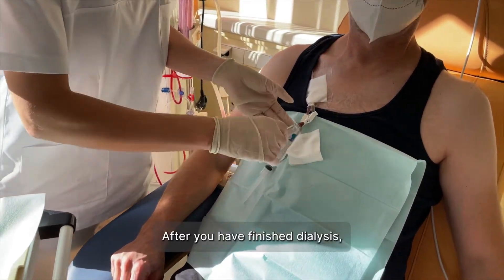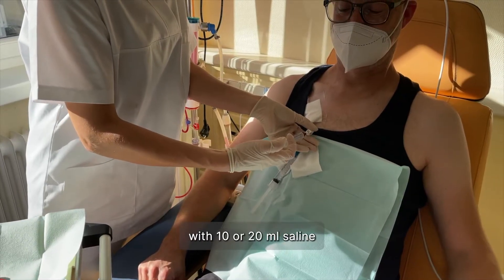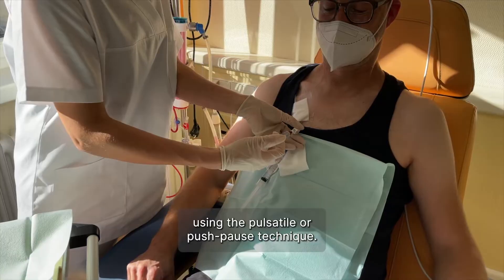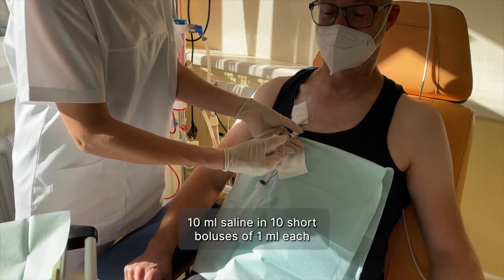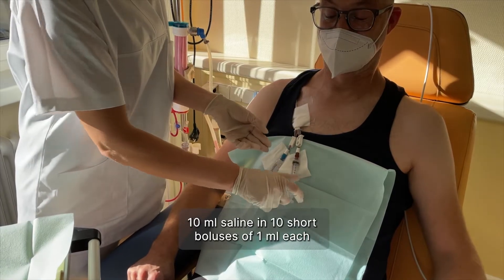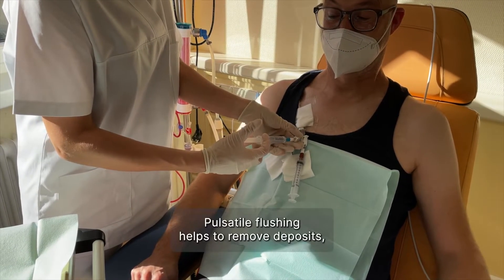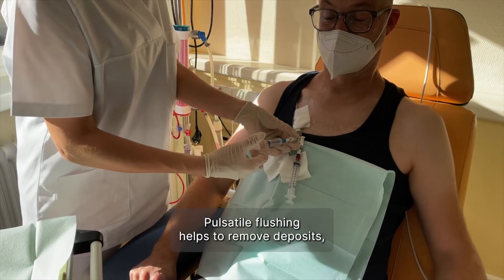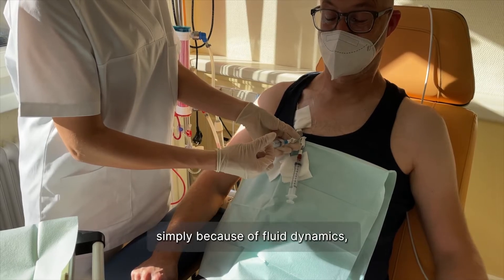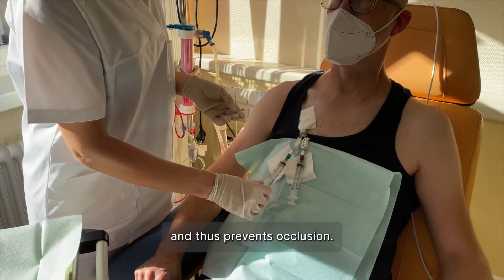After you have finished dialysis, we recommend flushing all lumina of the device with 10 or 20 millilitres saline using the pulsatile or push-pause technique — 10 millilitres saline in 10 short boluses of 1 millilitre each with short pauses in between. Pulsatile flushing helps to remove deposits, drugs, and fibrin from catheter walls simply because of fluid dynamics, and thus prevents occlusion.